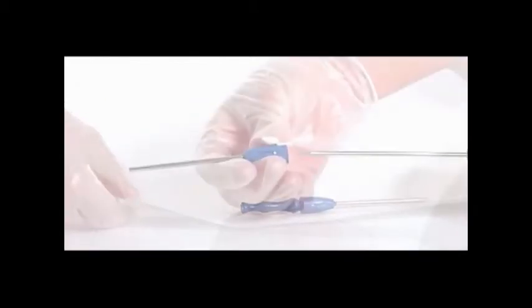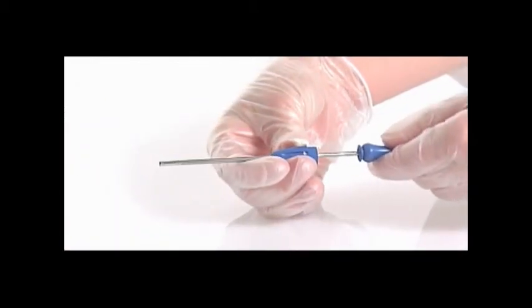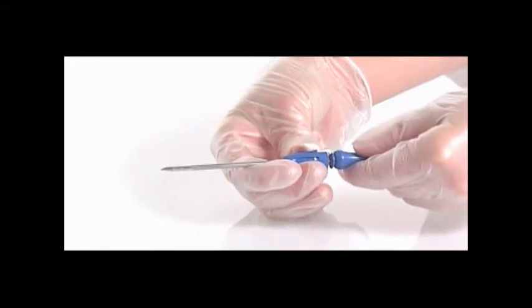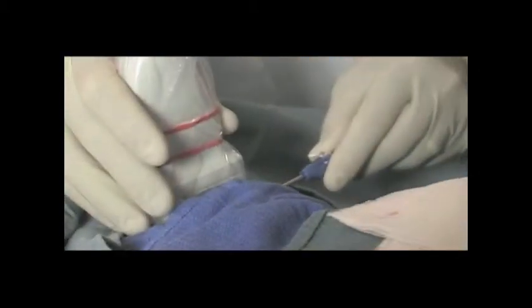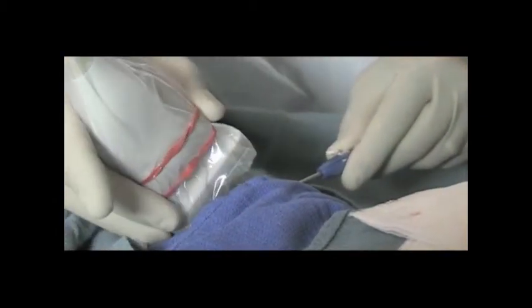Remove the Solero introducer and stylet from the packaging. The introducer set creates a pathway to the target site and maintains an easy entry system for the biopsy needle. Advance the introducer sheath and stylet as one unit into the breast through the skin nick to the target biopsy site. The stylet tip will marry up with the tip of the Solero prior to biopsy.